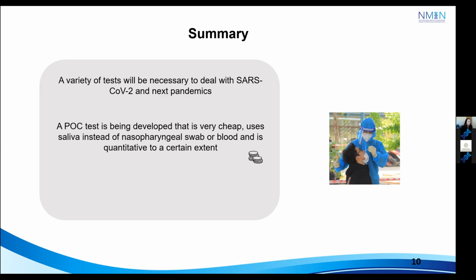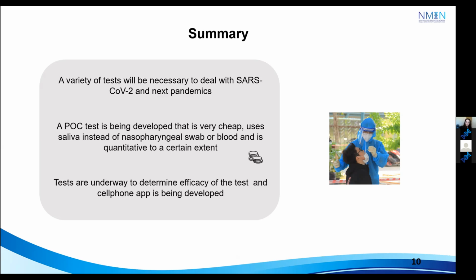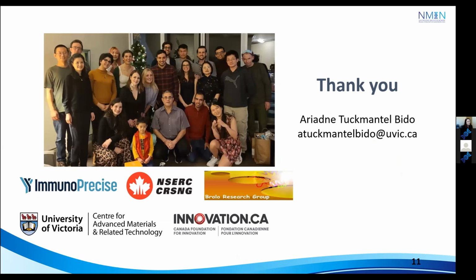So this would be a good test to deploy in busy centers as a screening test because it's very cheap and easy to use. If my shift was very, very big, I could see this change in color of the strip. But since as of now the shift is not very large, we cannot see it by eye. So we are developing a cell phone app in which you can take a photo of the strip, and then the reader will tell you if you need further testing, if you are sick, or if you are healthy. And thank you for listening to me.